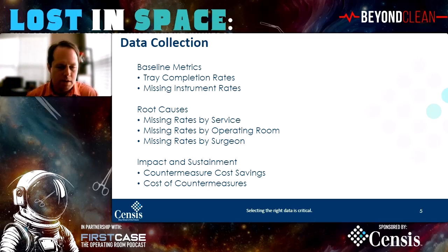And they had 5 or 6 of these things, and they were just filled with instruments that had gotten mixed up between trays, and they had collected and were actively working to try and get them back in the trays they belonged in. But just due to the volume of trays that they were processing and the normal pressures of running sterile processing and getting things turned quickly, they hadn't been able to do that. They also had collected instruments and started to organize them on a pegboard that was probably about 40 or 50 feet long. So huge operation here. But that just kind of shows the magnitude of this challenge.